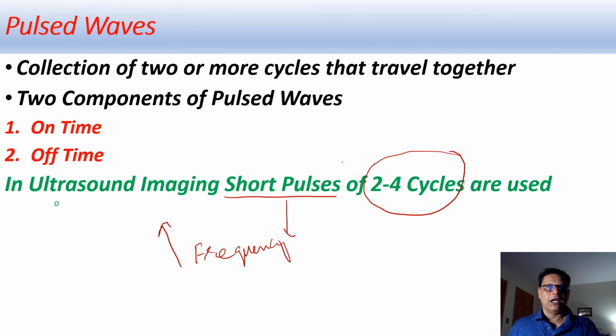And high frequency means high resolution. High resolution means good quality image.